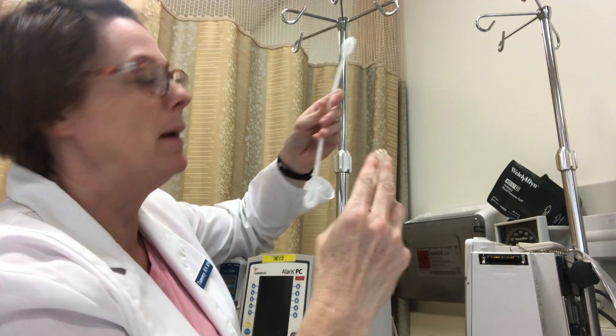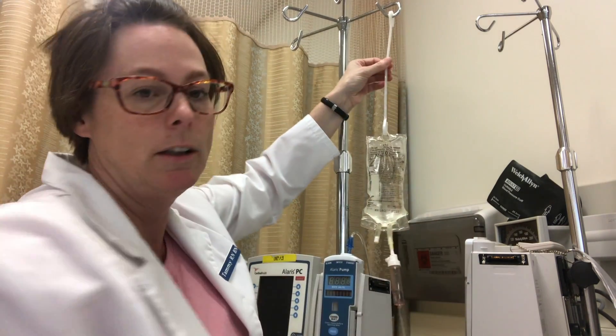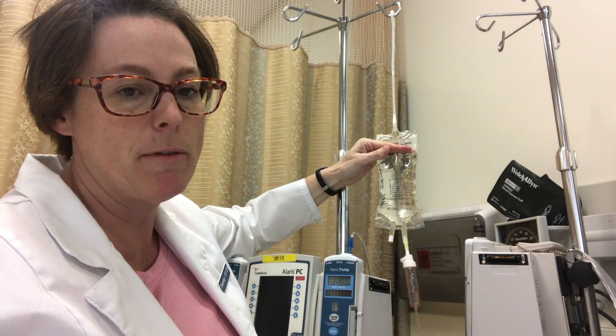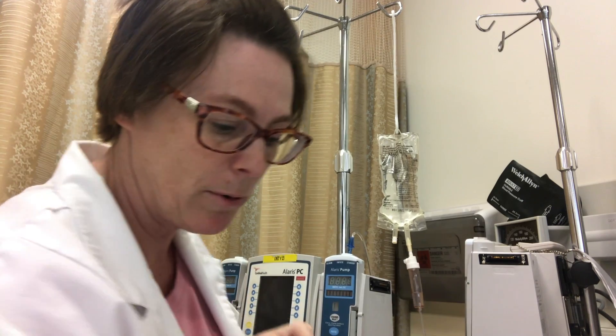I'm going to take my primary bag now and put it on the lower hook, because I need to have a significant difference — I believe it's 8 inches from the top of this fluid to the top of my secondary line in order for it to run properly.